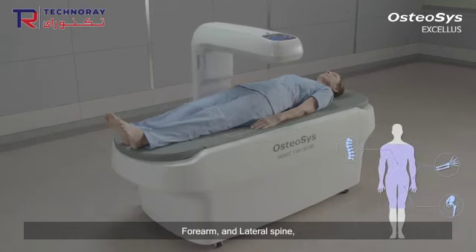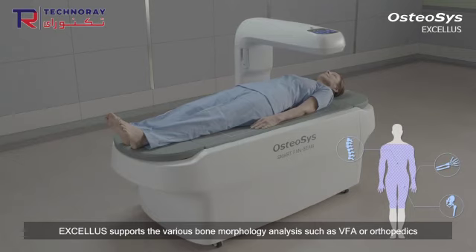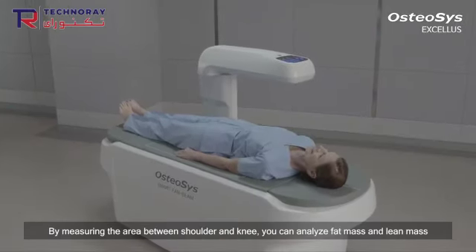From the basic measurement of BMD of AP spine, dual femur, forearm, and lateral spine, EXCELLUS supports various bone morphology analyses such as VFA or orthopedics.